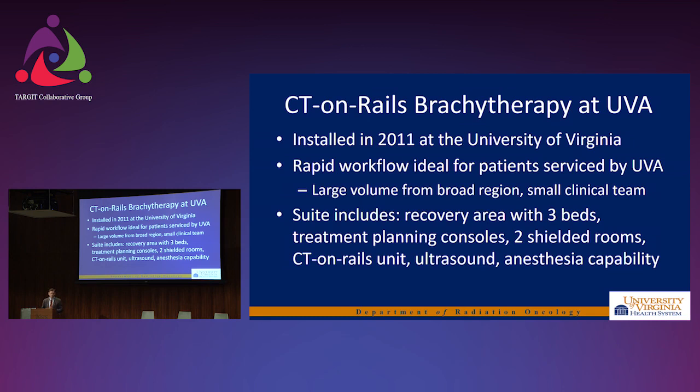We have a very amazing and persuasive GYN oncologist, who was professor emeritus at that point, and he said, we have all these women that come from Southwest Virginia and they drive hundreds of miles for their cervical cancer brachytherapy. Let's create a system that uses pretty standard approachable technology with the same sort of equipment, but can serve a very large volume of patients and get them in and out and back home more quickly. Practically speaking, we have a very small clinical team. For the first 2 years, the brachytherapy physician team was me, so we need to leverage the personnel that we do have.